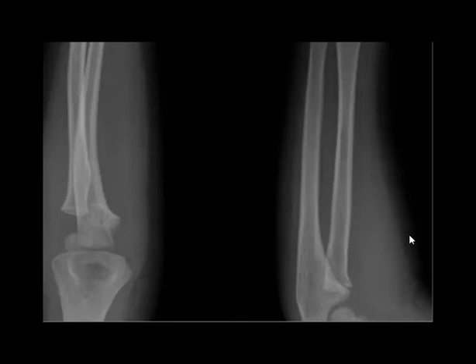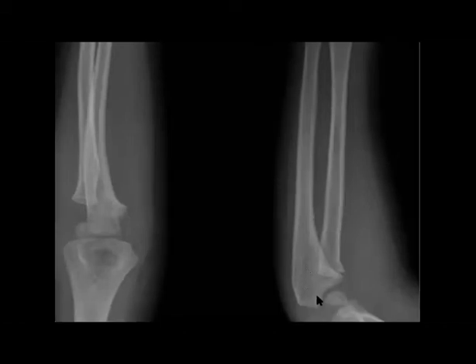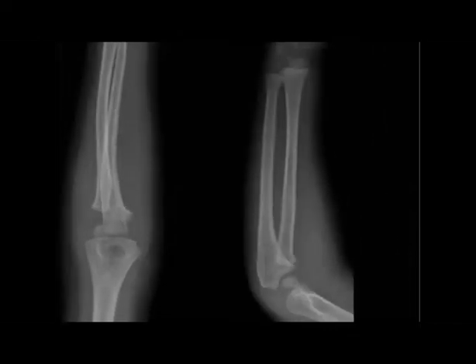So, ulnar, perfect. Proximal ulnar. You can see clearly that it is in the proximal ulna. Maybe here you can imagine it, but here it is more obvious in this view. Nice.